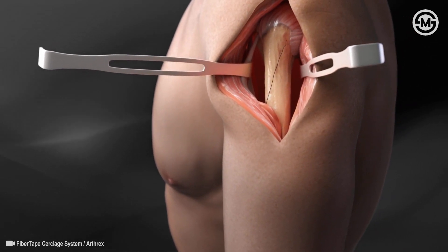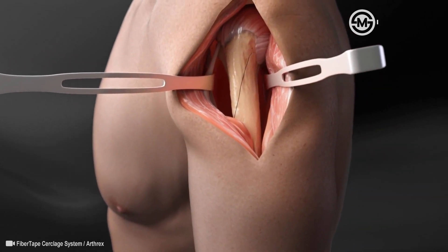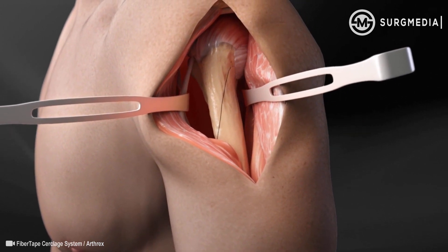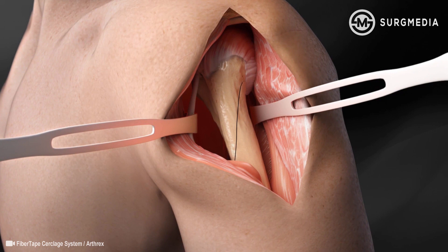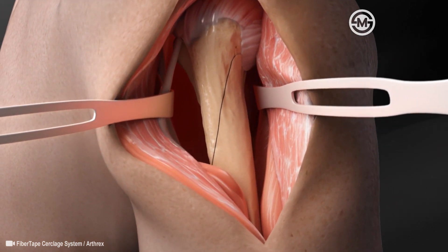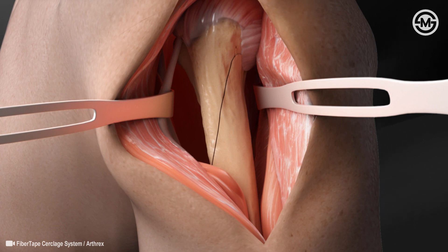Fiber Tape Circlage is a radio-translucent suture that eliminates the need for metal cables and wires for fracture closure without sacrificing the strength or security of the repair. When circlage is needed for fracture repair, the Fiber Tape Circlage system can be used to reduce and secure the fracture site.